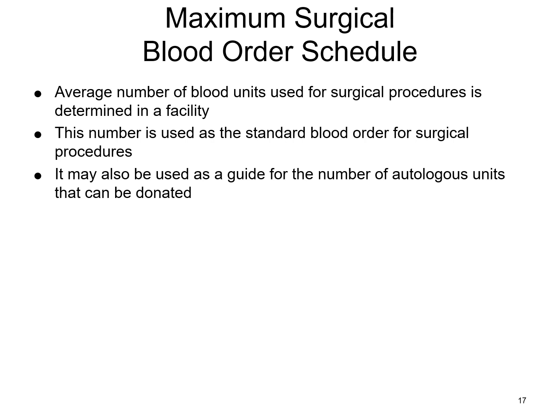And so they may say, let's just say for a cardiac open heart surgery, right off the bat, their standard order would be 4 units. That's their standard blood order, to order a cross match for 4 units as part of that pre-surgery workup. Maybe some of your orthopedics would get just a type and screen so that you would have it available if something arises. You've got a tube on hand, but you're not really setting up units for that patient.